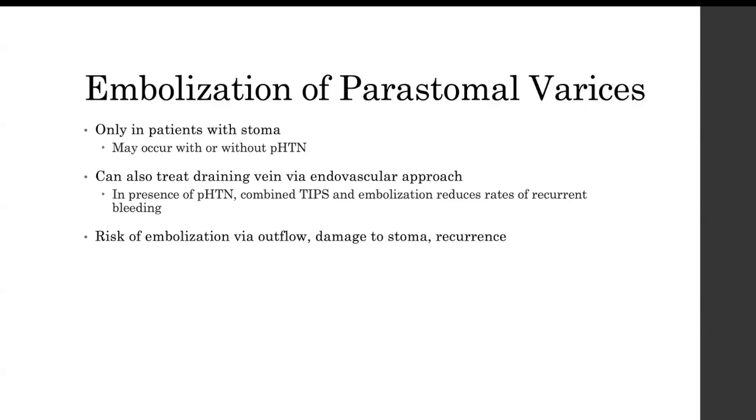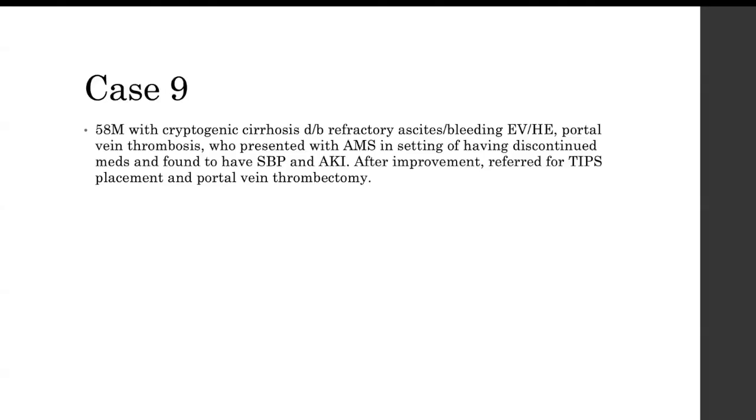So draining the vein, well, basically treating, you can do the tips, you can treat the draining vein, and you can do both of those simultaneously if it's really needed. But keep in mind that when you're doing these sorts of things, you can damage the stoma because these veins are, I mean, you're embolizing parts of the stoma. So there is a risk that the stoma is destroyed. So it's always important to have surgery aware that you're going to do it. Okay.